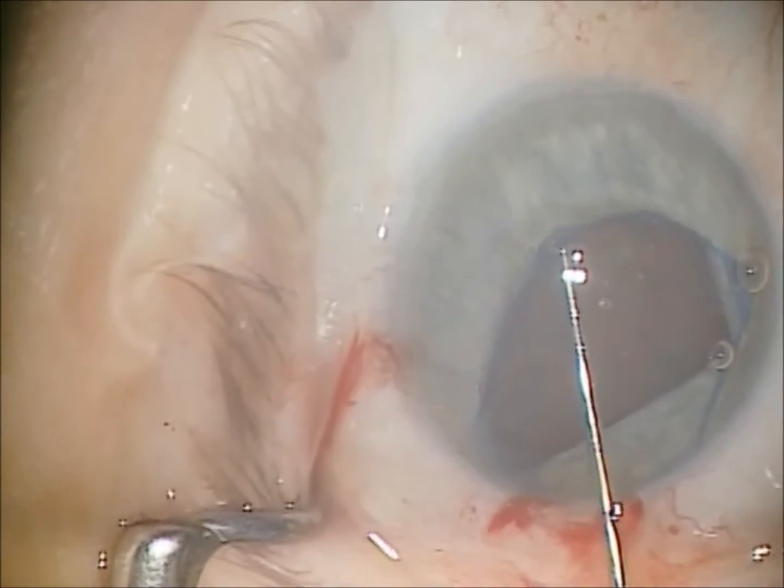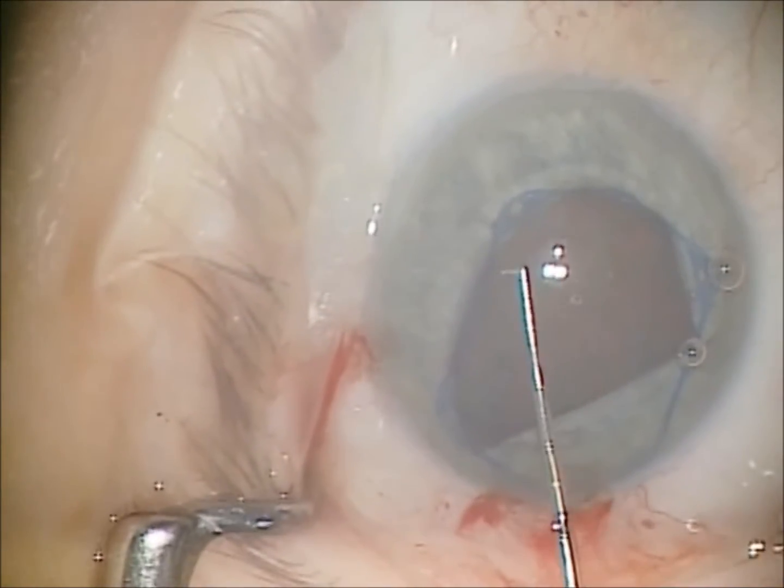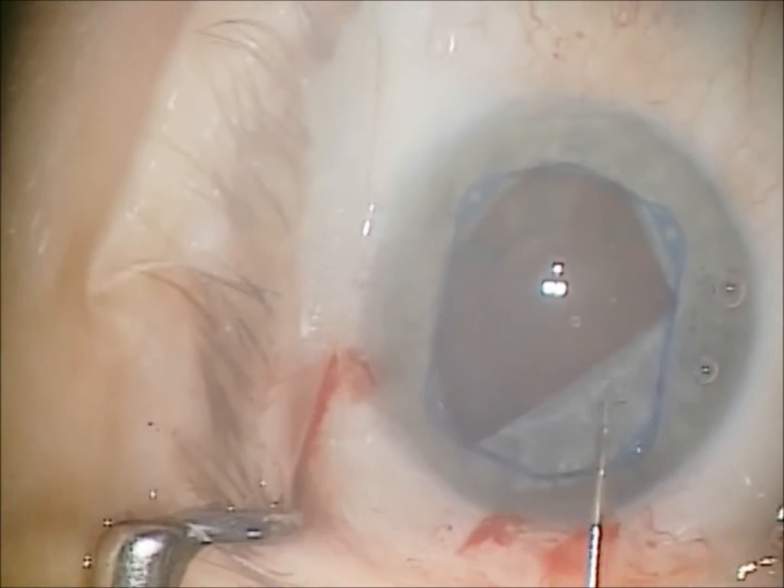Something you'll readily notice is that you'll see iris edge at the corner after insertion of each corner of the dilator, and this is normal. This is what you should expect to see.